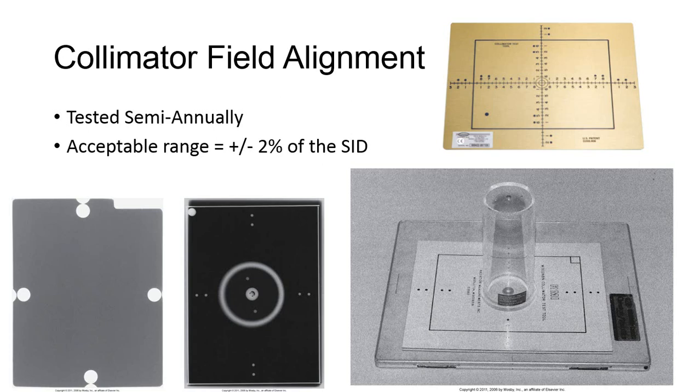Acceptance limits are ±2% of the SID. Most of these test tools are created for testing at a 40-inch SID, but in metric, that's 100 cm, a nice round number to know the value of 2% for acceptance limits. If the SID is 100 cm, then the radiation field on the image should be within 2 cm of the line that you collimated to.